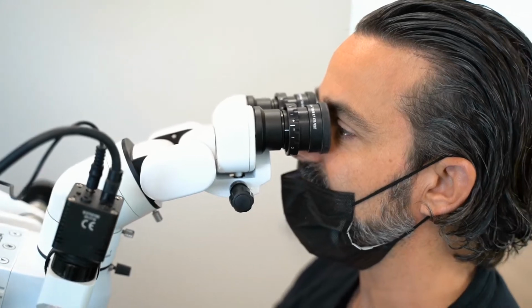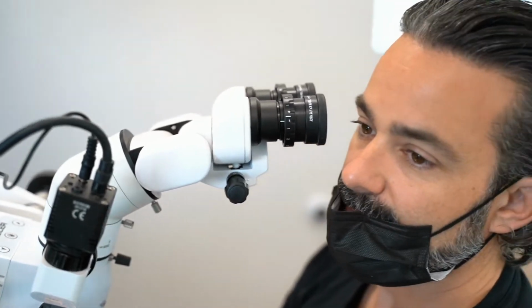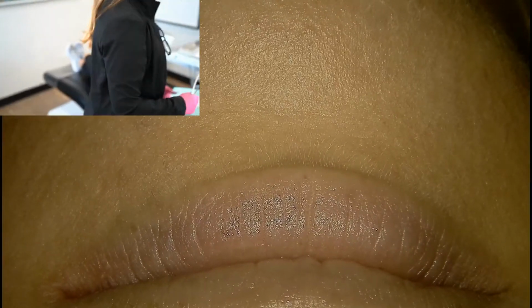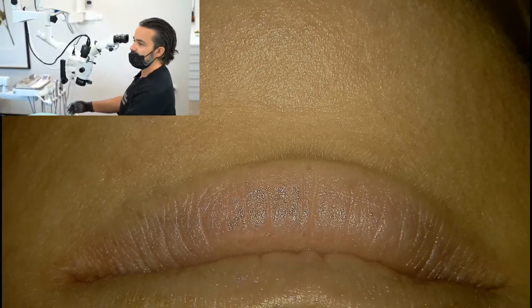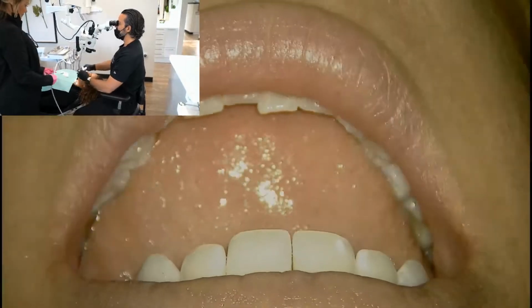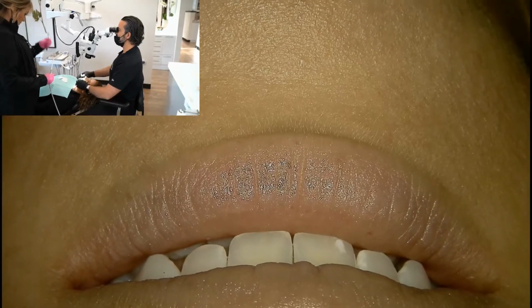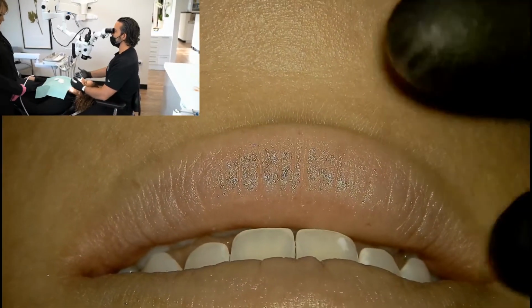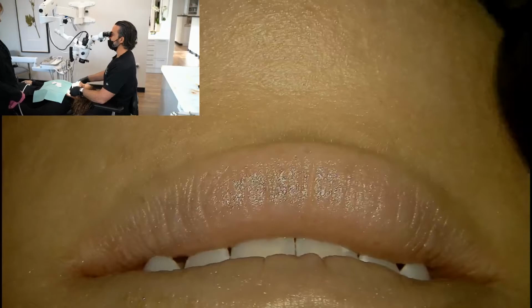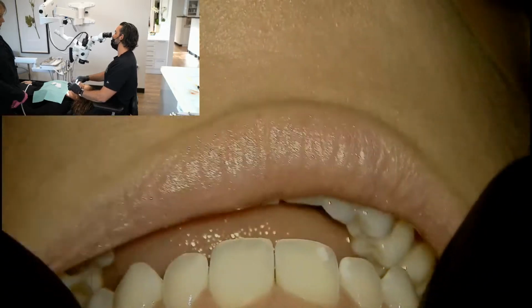If I come back to my patient, if you want to get it on both feeds, if you want to go out and look at the whole environment, Mike, go out to a corner. Sure. So this is how I work. There's always that wasted movement in space, but when I'm like this, things are always in focus. I'm in control. If a patient is swallowing or moving, I have access to the chin open wide. Very easy to work around.